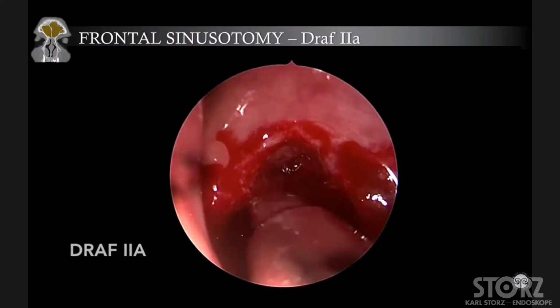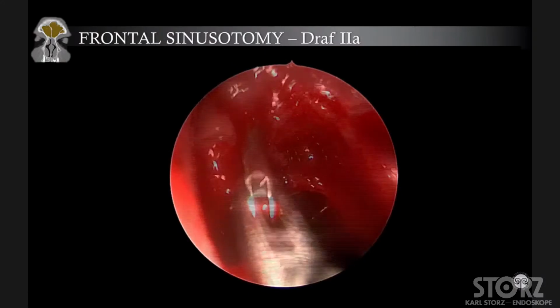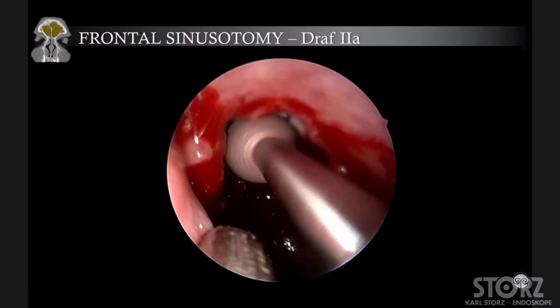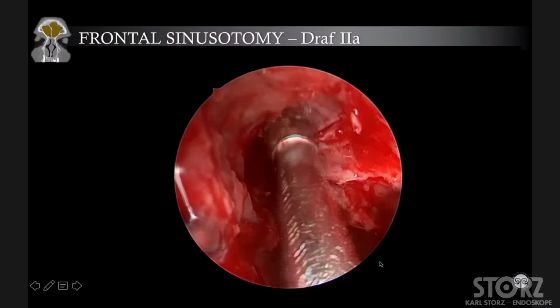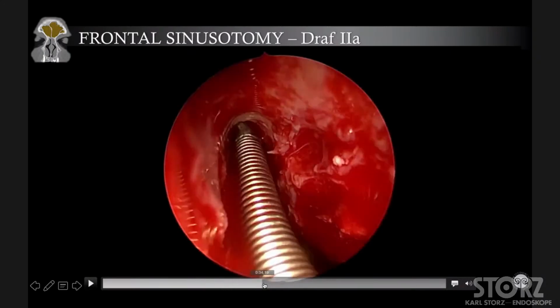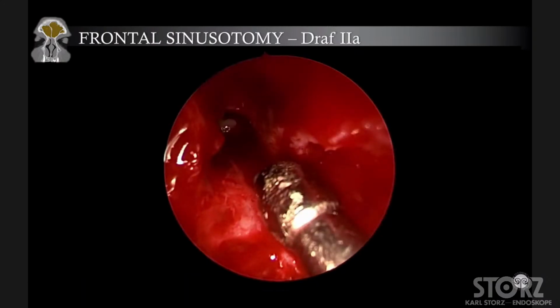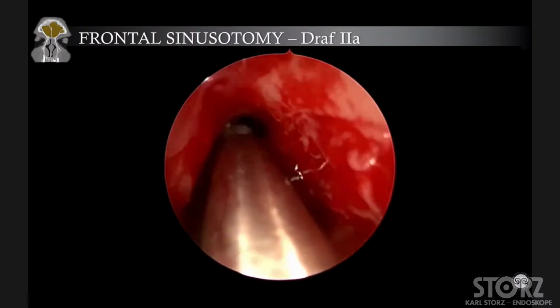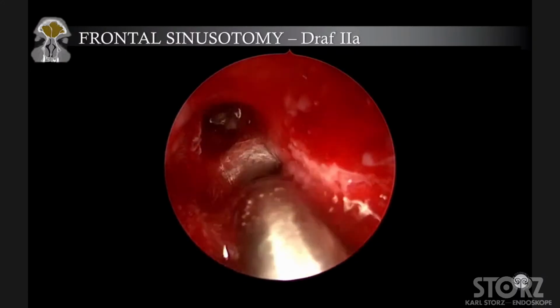Once again, I show you Draf type 2A. In Draf type 2A, we have to enlarge the opening until the insertion of the middle turbinate. So we have to drill out, or cut, the floor of the frontal sinus until the insertion of the middle turbinate, like in this case. We are opening all these structures. Once all the structures are open, you can see some pus, some secretion inside the frontal sinus. You can do some rinses and some irrigation inside the frontal sinus in order to clean the sinus from the secretion.